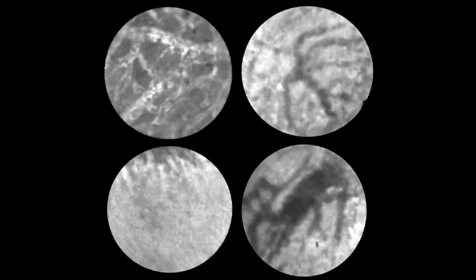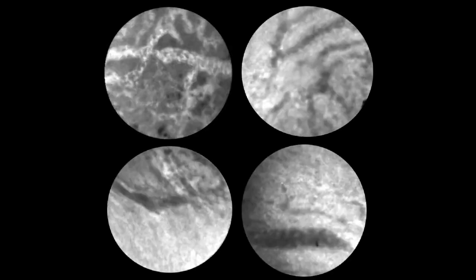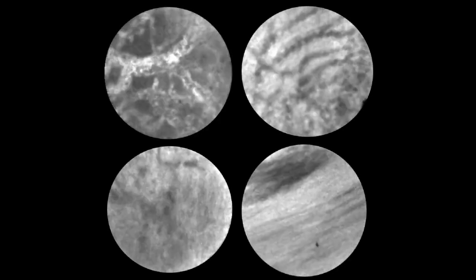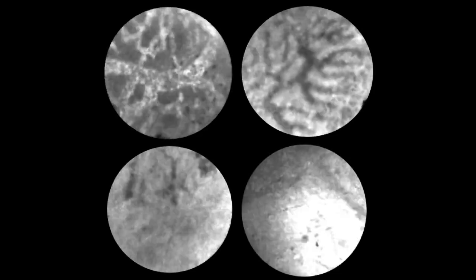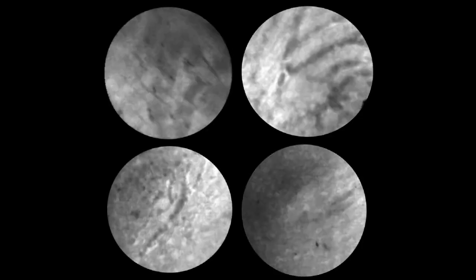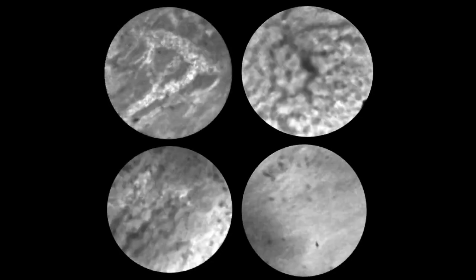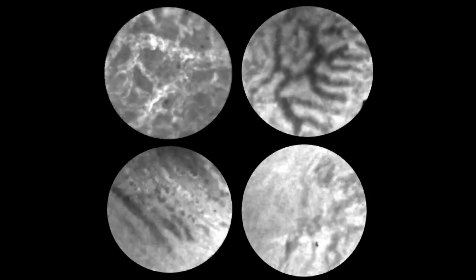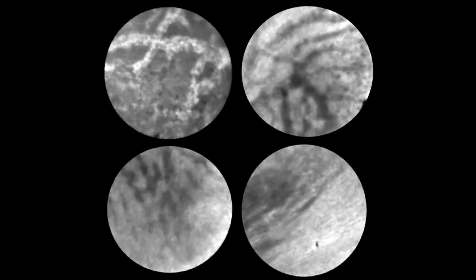Here are 4 different patients with serous adenomas showing the fern pattern of vascularity. These are essentially the capillaries which occupy the entire cyst. When we do endomicroscopy, these images move very quickly, and we get to see this beautiful pattern of blood vessels. Essentially, there is a central blood vessel from which other blood vessels branch off. You get to see RBCs floating within these blood vessels, or sometimes blood vessels packed with RBCs.